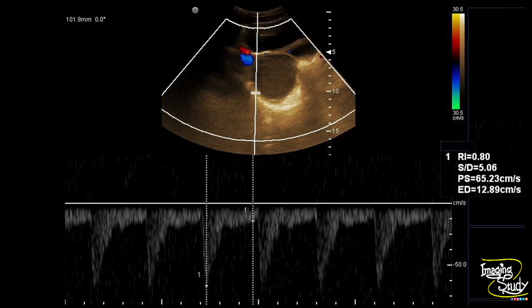On color Doppler, we cannot see any flow within the lesion. The most adjacent vessel shows moderate to high resistant flow. The resistive index was 0.8, and you can see an early diastolic notch, indicating this vessel originated from the uterine artery.